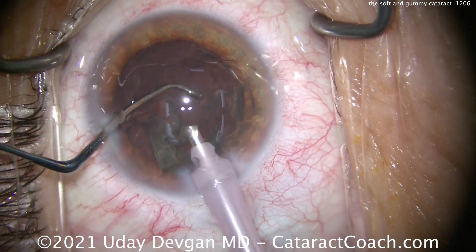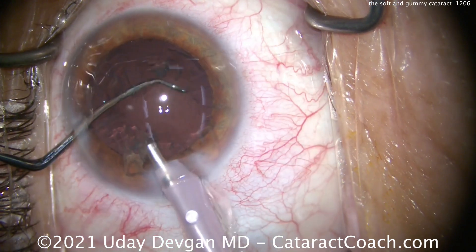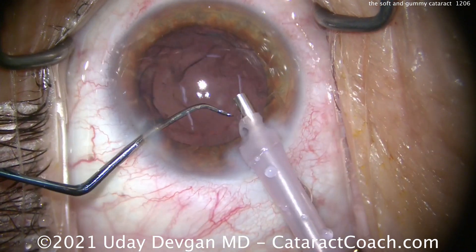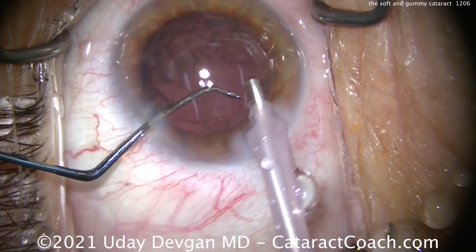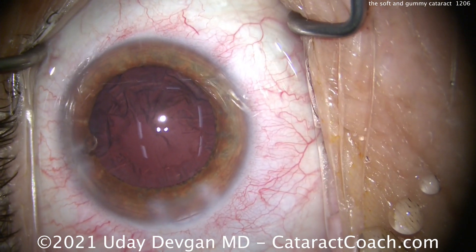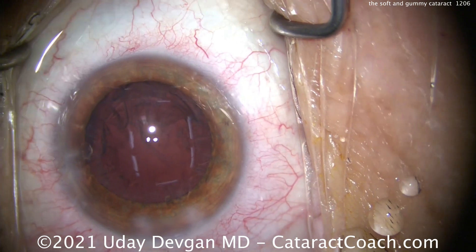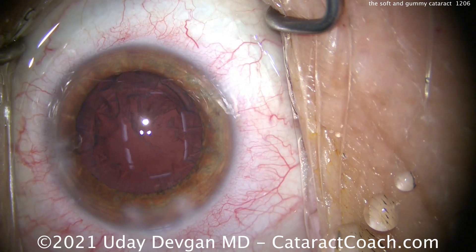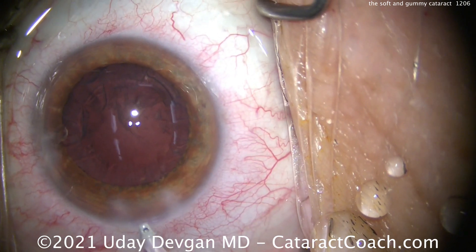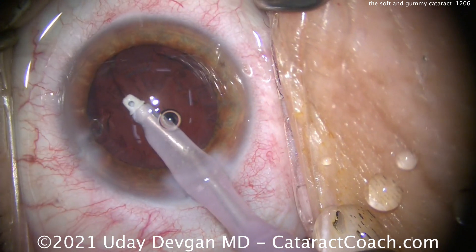I want to show you this case so you can see the whole variety and spectrum of cases that we get. This is one of the reasons why cataract surgery is just so much fun and why I still love it even after more than 20 years — because every case is actually a little bit different. You never know exactly what you're going to get, and that's the fun of it. We've got the nucleus out. The rest of the case is going to be pretty routine, but the nucleus removal took longer than normal even though there wasn't that much nuclear density.